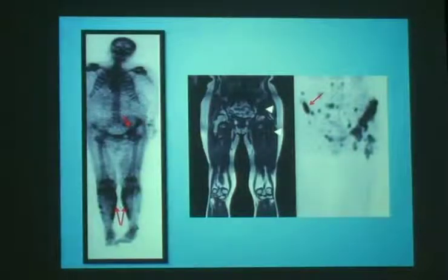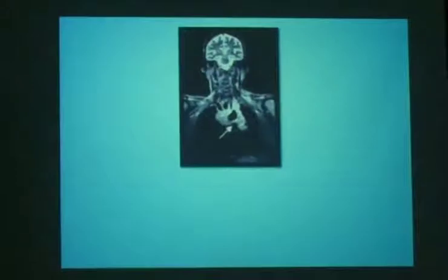Now, this is not explaining this metabolic super scan, nor is it explaining this diffuse subcutaneous tissue uptake. This was later on explained by hyperparathyroidism, a paraneoplastic syndrome secondary to the small cell lung cancer. So in this case, we can see that MRI played a role in detection of the soft tissue affection, but the bone scan raised the suspicion that there is something else happening in the body, and actually this was explained by the hyperparathyroidism.